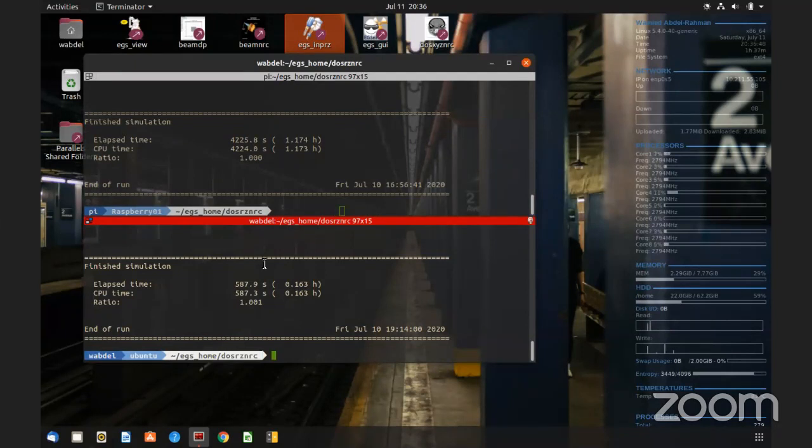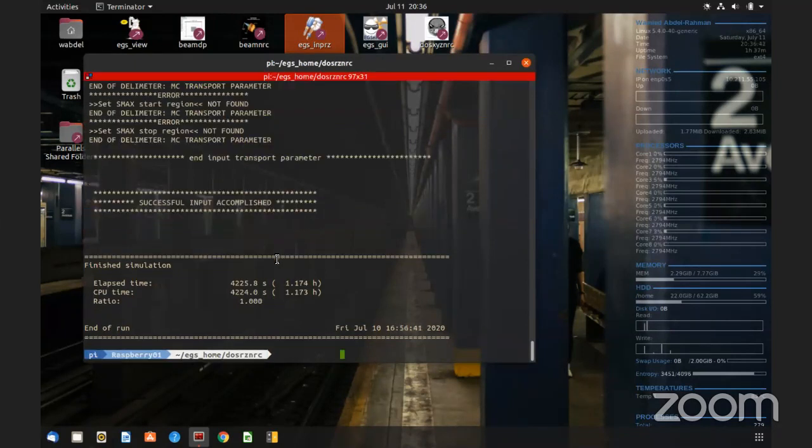So I've installed a cluster, or I made them as a cluster, and I'm running something called Slurm. This is a distribution. It's a manager. Basically, you submit jobs to this Slurm. I think it stands for Simple Linux Utility for Resource Management and so on. You submit it to Slurm.